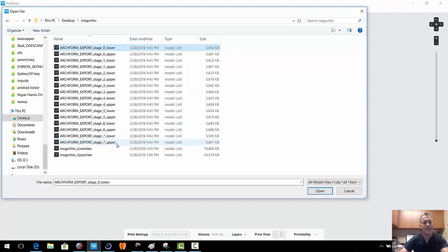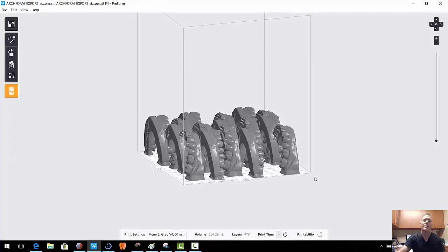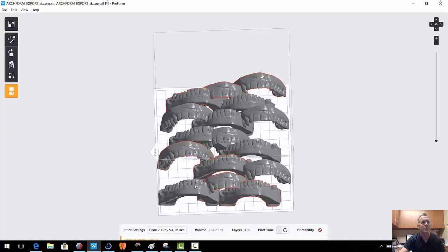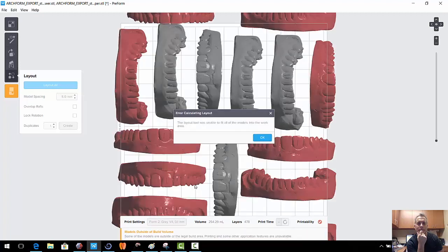So it generates a total of 7 sets of aligners and 1 for attachments. So we'll hit open. We can select to be printed vertically, and it will come out of the software already straight up and down. So you can see that we have quite a few. We can try to hit auto arrange and lay out all and see if it gives us any help. Nope, doesn't look like it.